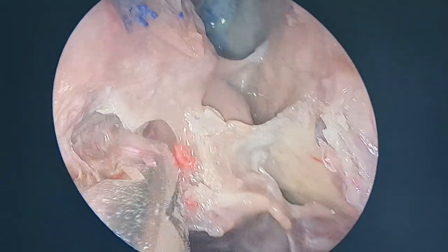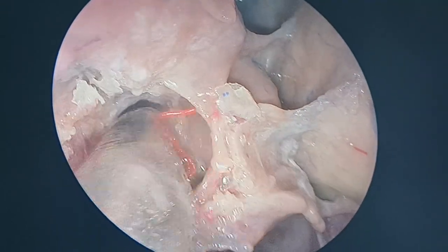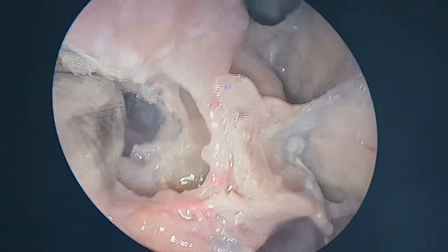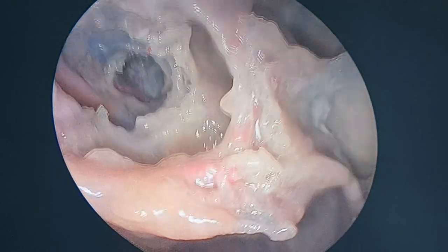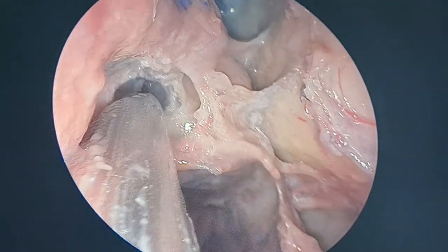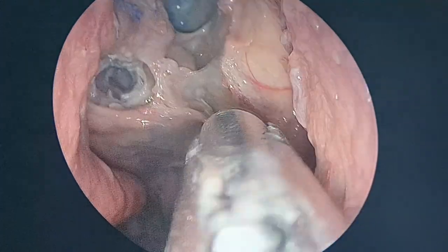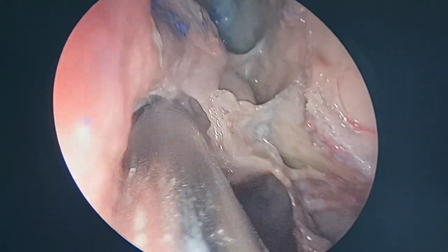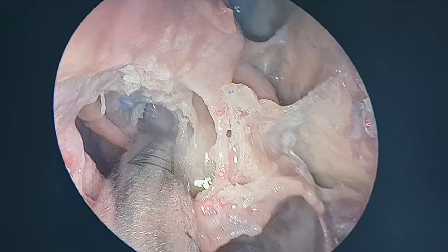See this. Let me make a window. I think it looks cloudy. One more. Now see, I'm staying medially. I'm not dissecting the posterior ethmoidal cells. I'm at the level of the maxillary line, staying medially. This is one of the best life-saving steps. Stay medially and see what is there.